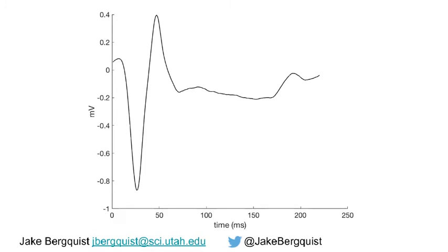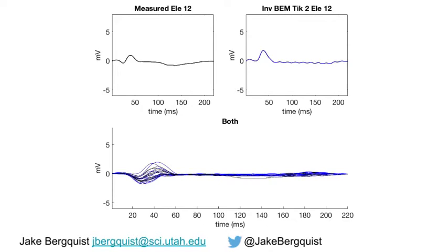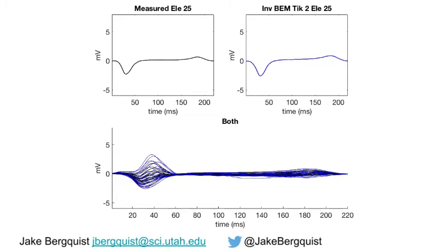Here we will look at the measured signals in black and the reconstructed signals in blue using boundary element method and Tikhonov's second order. We'll scroll through all the electrodes, and I'll go slow at first so you can see them and then speed up. Notice how the inverse reconstructed signals tend to be a little bit noisier than the measured. However, the amplitude and the morphologies match rather well. The morphology matching gives rise to the high temporal correlation that we observe.